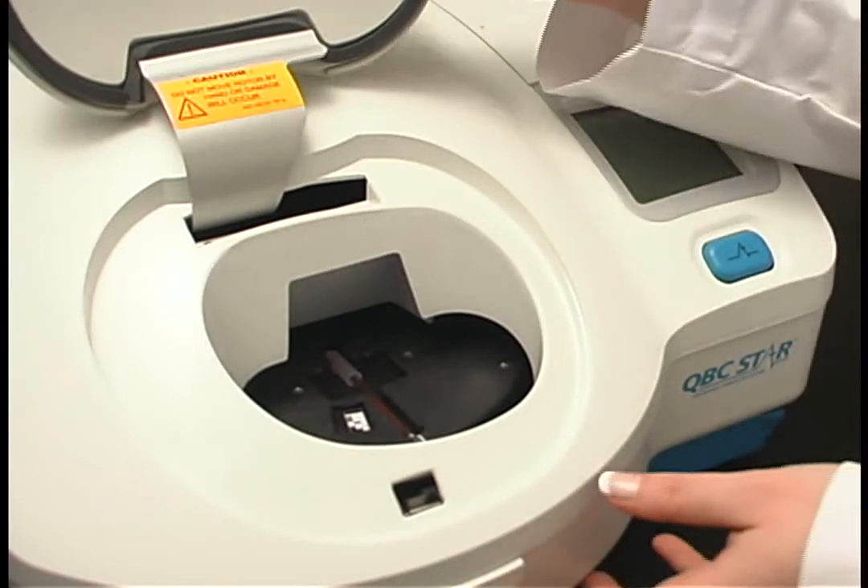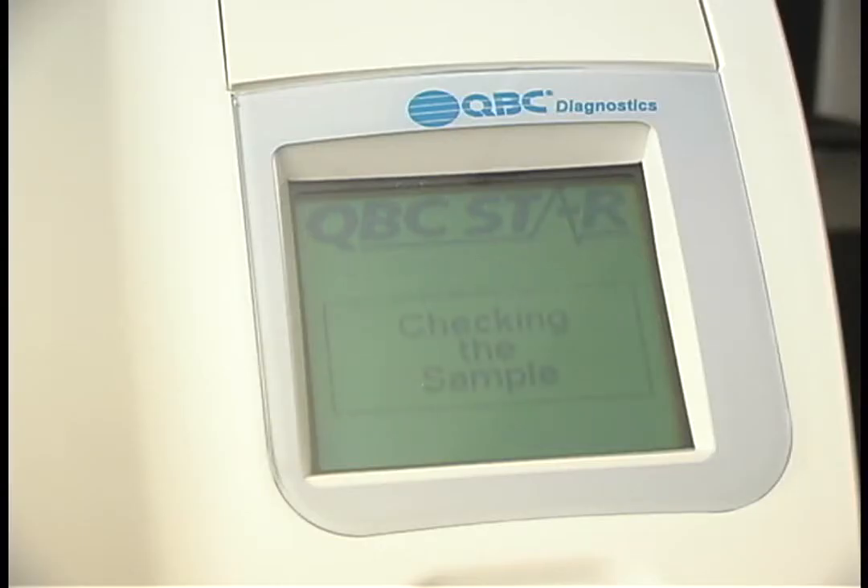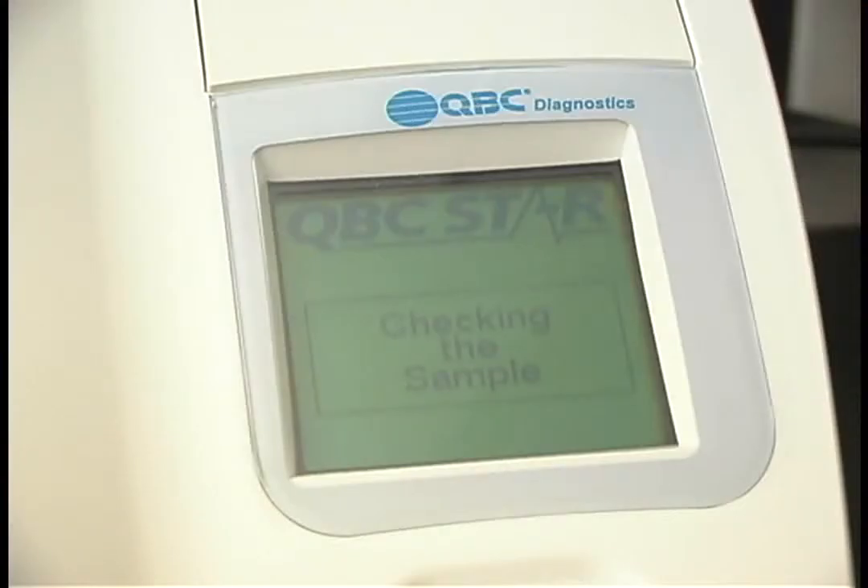Once your information has been entered, shut the sample door and press the star button on top of the star unit. The star will first check the tube position and make sure that the sample has been capped correctly. Remain with the star during this check in case the instrument determines that the sample was not prepared correctly. Once the check has passed, the star will enter a mixing cycle. At this point, you're free to walk away from the analyzer if you so choose.